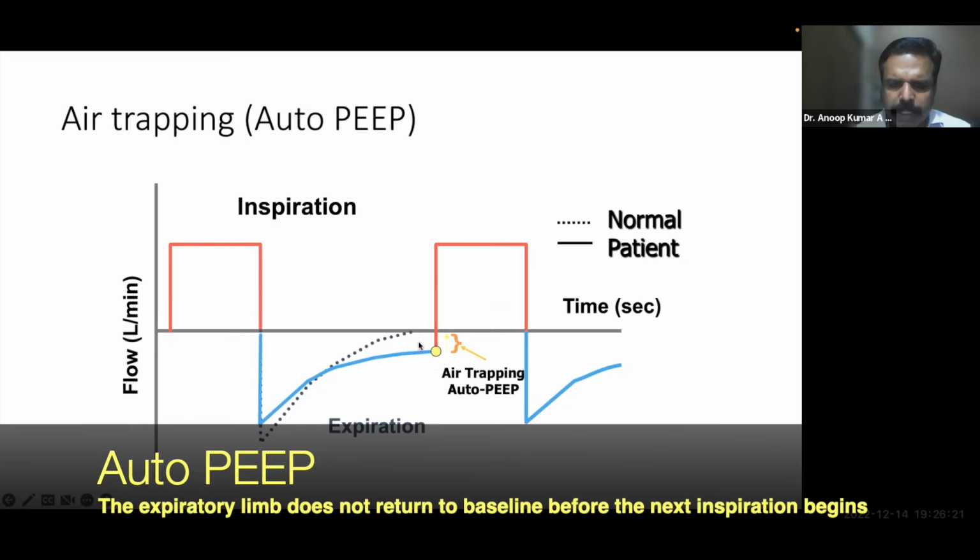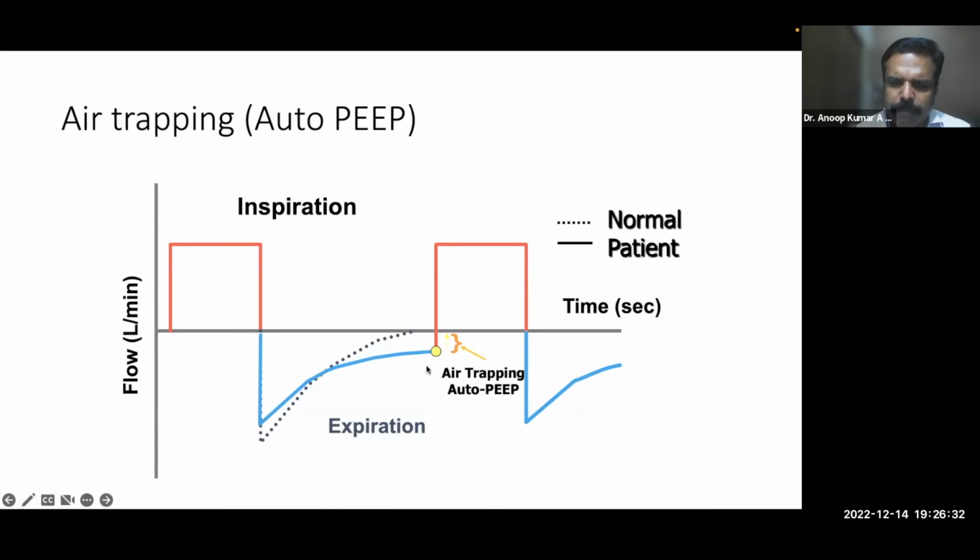So in this expiratory flow limitation, before the alveoli are completely emptied, we are again giving one more breath. So the air will get trapped in the alveoli. If you have repeated such episodes, more and more air gets trapped inside the alveoli, so the alveoli will get distended. Intrathoracic pressure will increase. So what will happen if intrathoracic pressure increases? Definitely your venous return will reduce. So that will again lead on to circulatory collapse. That is one part as far as the hemodynamics are concerned.